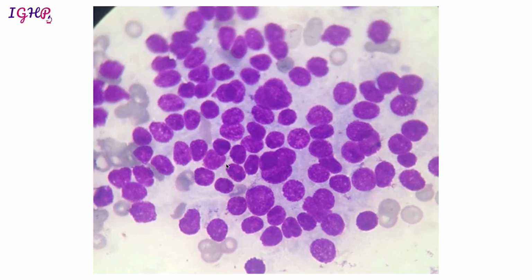So for this again you could see that this could represent the lesional tissue that is present in the mass. Most of these cells are similar looking, so they've got a uniform monotonous appearance. They've got ill-defined cytoplasm, there is no definite cytoplasmic boundary, and the nuclei are looking finely vesicular. So this monotonous appearance is usually seen in a neuroendocrine tumor, and if you are thinking of a neuroendocrine tumor, again you would like to take a cell block to do your immunostain.